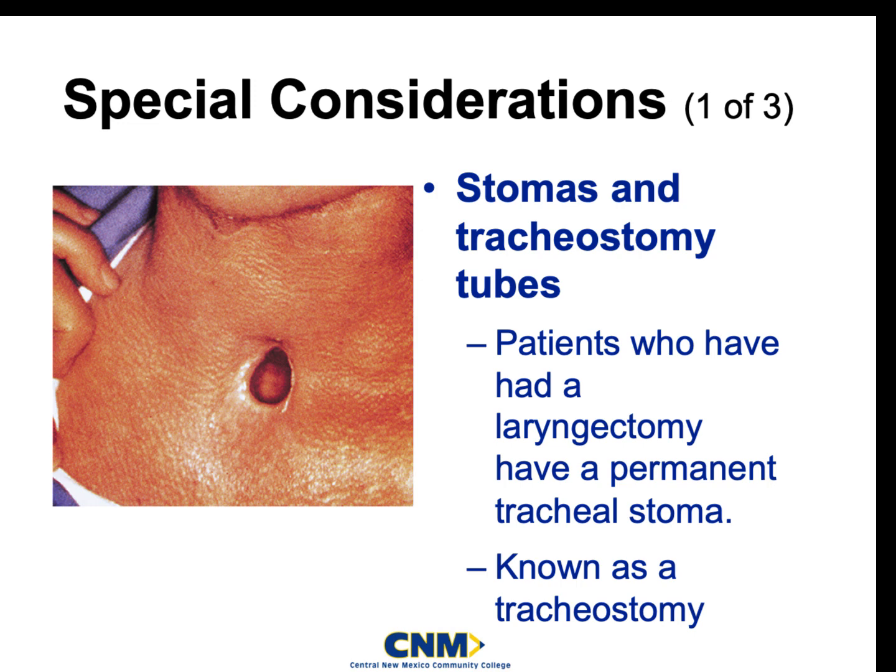However, every now and then you guys might need to suction that out. And I'll tell you, suctioning out a trachea is not the most pleasant thing in the world. Again, they are not able to necessarily filter the air that they're breathing in appropriately. So you can get some really nasty, smelly phlegm out of these bad boys. And I'm talking like slime. I'm talking like where you can start suctioning, and you go to pull that suction device out of there, and all this phlegm is just kind of stringing out with you. Okay.